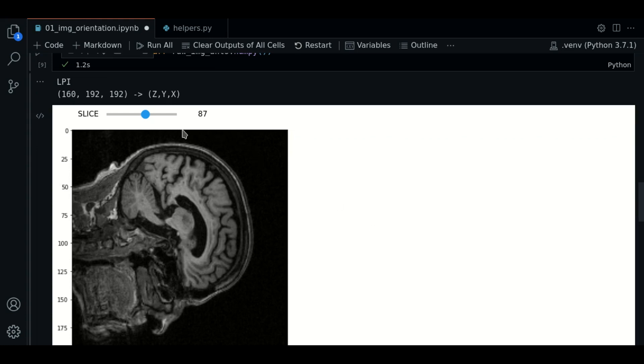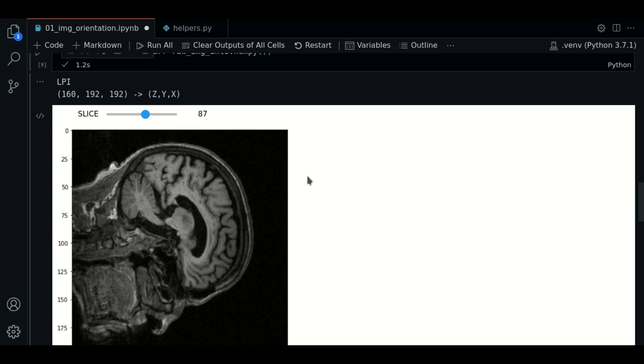The second axis goes from top to bottom. In the two-dimensional plot, we have posterior to anterior. And in the third axis, it goes from left to right in the two-dimensional plot. This is from inferior to superior.